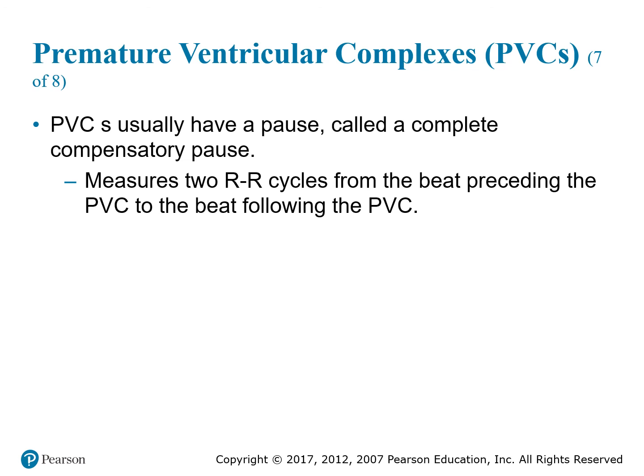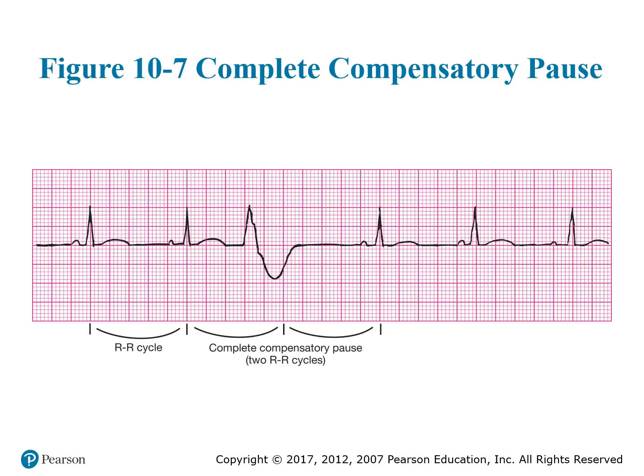A note: it is important to note that the presence of a full compensatory pause does not reliably differentiate ventricular ectopy from atrial ectopy. This is because atrial ectopy may produce a similar compensatory pattern if it does not reset the SA node. So, this is what we call a complete compensatory pause.